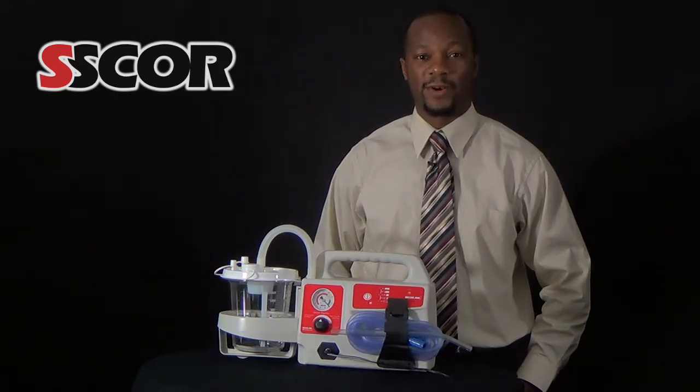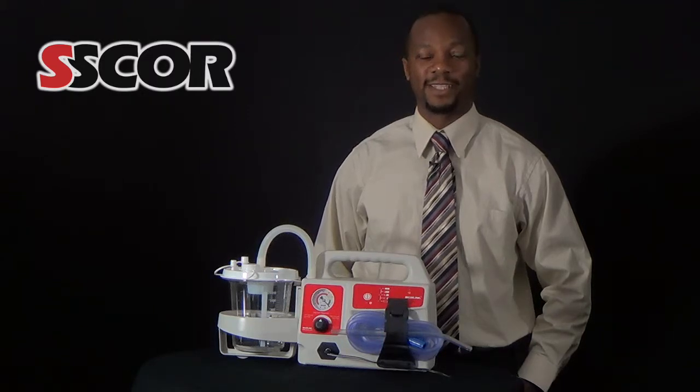SCORE recommends changing the battery at least every three years. Thank you for your interest in SCORE products.